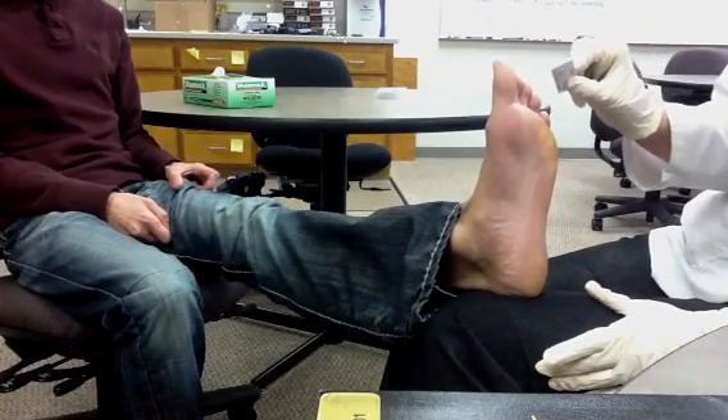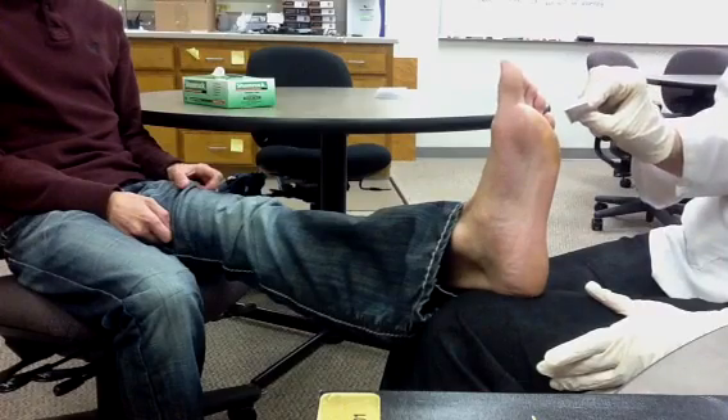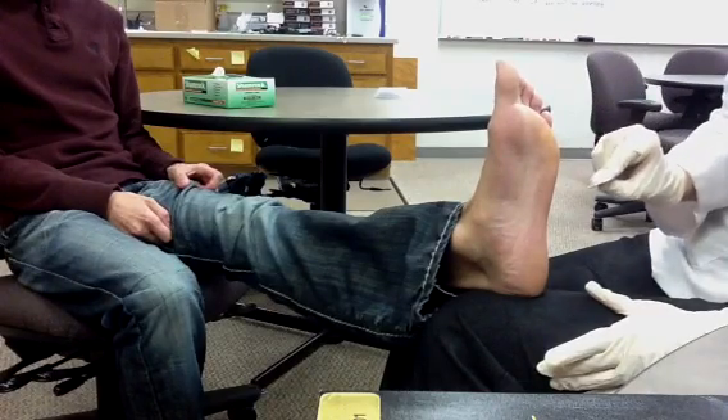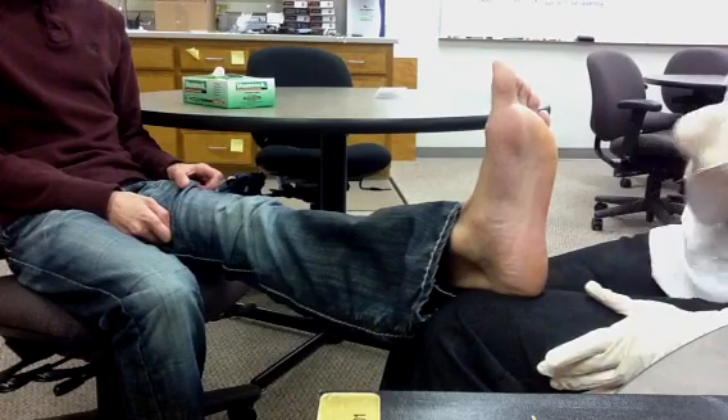The patient responds affirmatively to each monofilament touch point as the 10-point exam is completed on both feet.